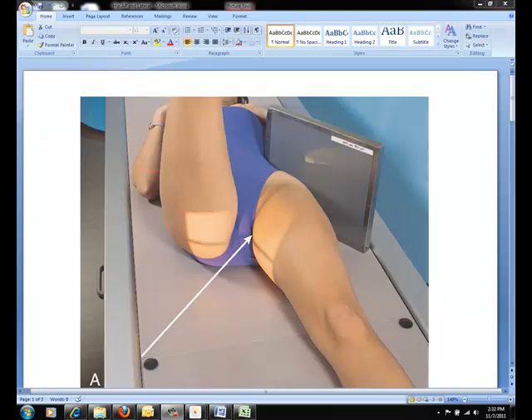For the Daneaus-Miller method, or the cross table lateral, flex the hip and the knee of the unaffected side and elevate the thigh into a vertical position. This is done to get the thigh out of the way of the central ray. You may wish to rest the unaffected leg on a suitable support that does not interfere with the central ray.